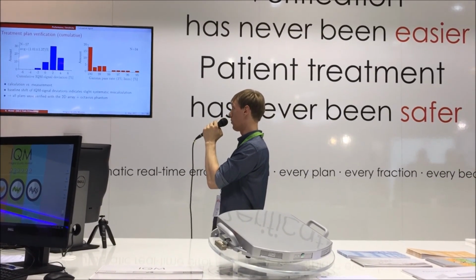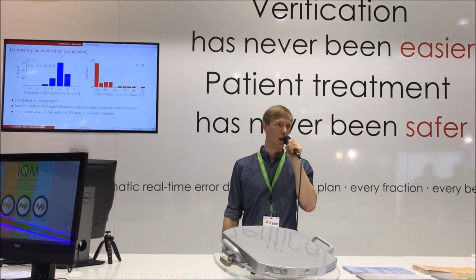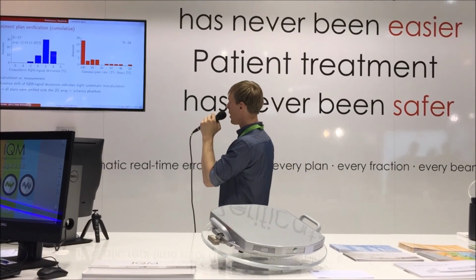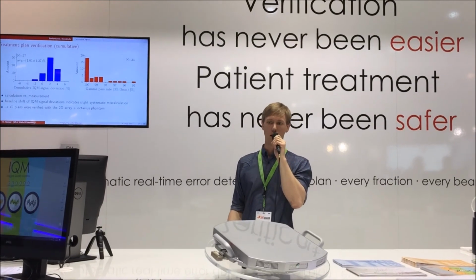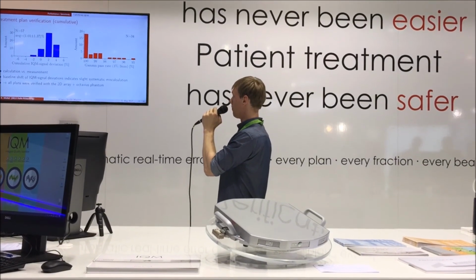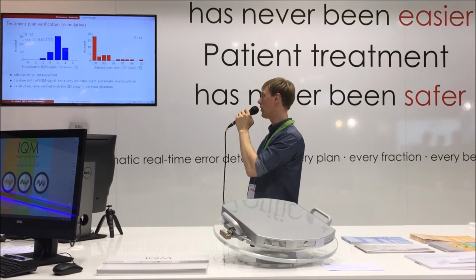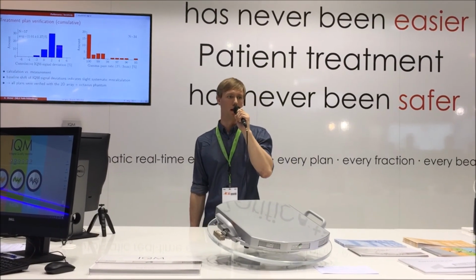And here we can state that we see a pretty decent standard deviation of only 1.4%. You can think back to the long-term signal stability test that I just showed you that revealed a threshold of plus minus 1%, but we can still see a 1% baseline shift of the signal deviations compared to their calculated signals towards positive percentages, and this we interpret as a relevant miscalculation of the signals themselves, because all of the plans were indeed verified with the two-dimensional array within the Octavius Phantom, achieving a gamma passing rate of minimally 95%.